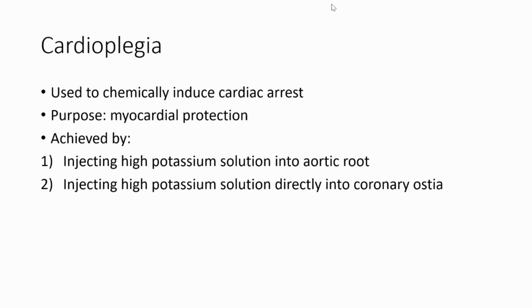The reason you would do that is if the patient has bad coronary artery disease, and that's the reason we're operating on them, then we can't guarantee that just giving cardioplegia solution down those bad coronary arteries will sufficiently expose the heart to high potassium and cause it to arrest. So we do a dual-pronged approach. We may try antegrade, but also retrograde. By filling the veins with enough of the solution, it should also perfuse the heart and cause the heart to arrest.